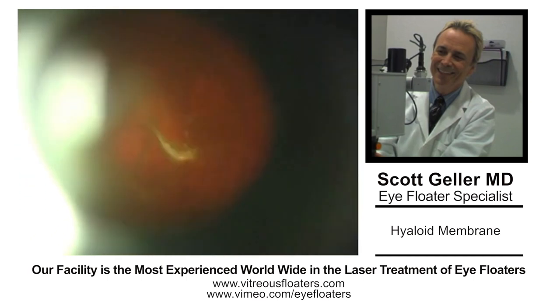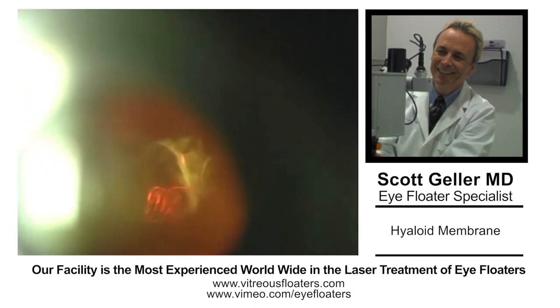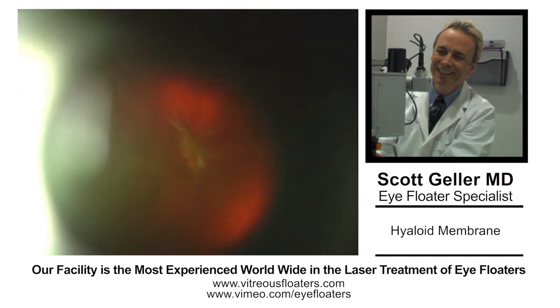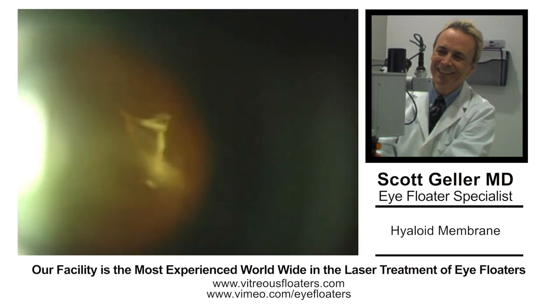This patient is a phakic patient in his 50s. He was offered a vitrectomy but did not want to proceed because of the problems of cataract and other possible complications with vitrectomy, which are very, very rare in my hands with laser vitreolysis.